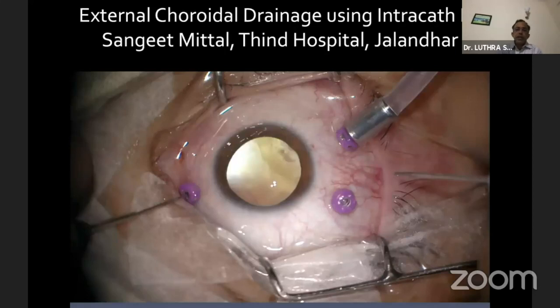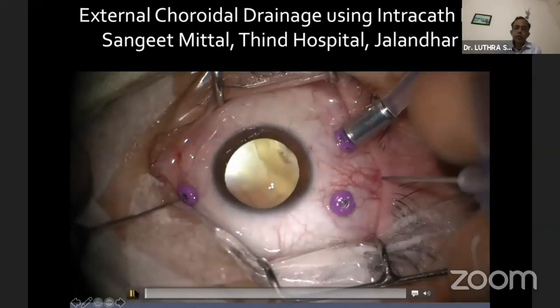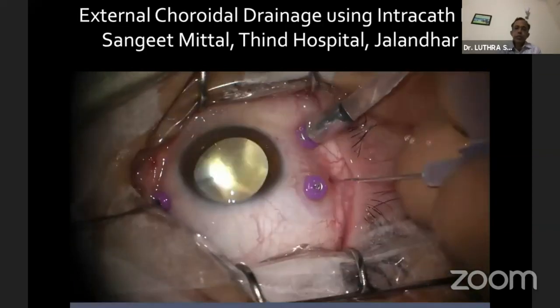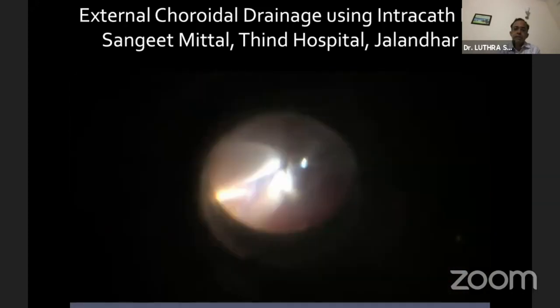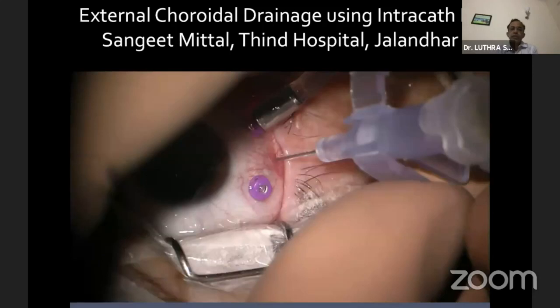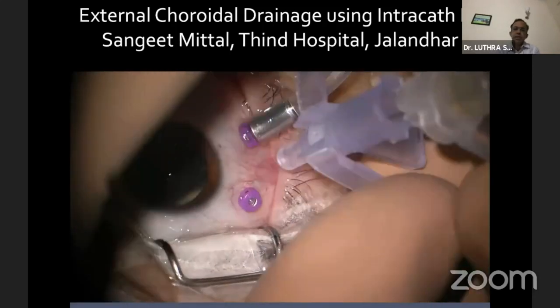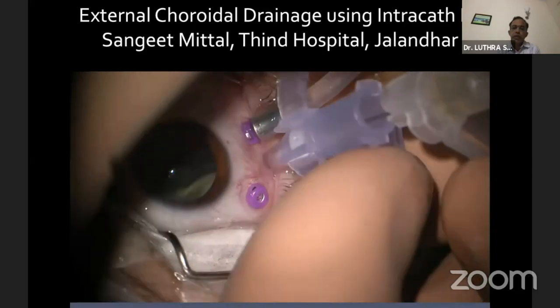And another technique which has been described by Dr. Sangeet Mittal is using the intracath, or the controlled cannular drainage of the choroidal detachment. I'll be showing his video now. So he uses this controlled cannular drainage with the intracath, which is put into the suprachoroidal space.